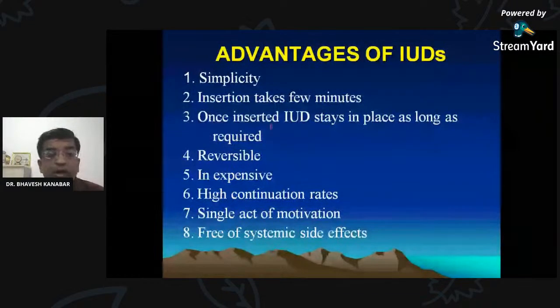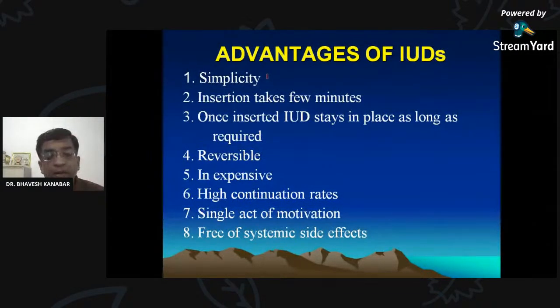So you are right. Advantages of IUD: simplicity, simple to insert. The technique is very simple. Once you learn this technique, there is a special applicator available for the insertion of the IUD, and it is an OPD procedure. The patient need not be admitted. Even the FHW, female health worker, ANM, even ASHA, she also knows how to insert the IUD. But generally, FHW and ANM perform this activity.